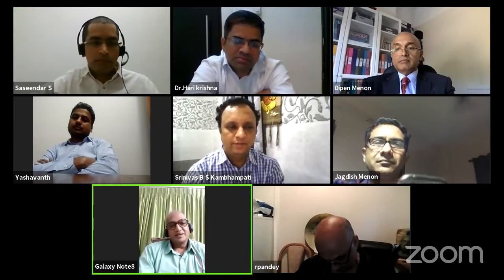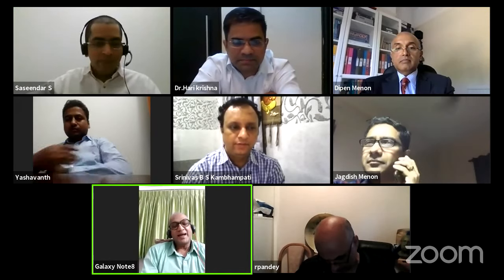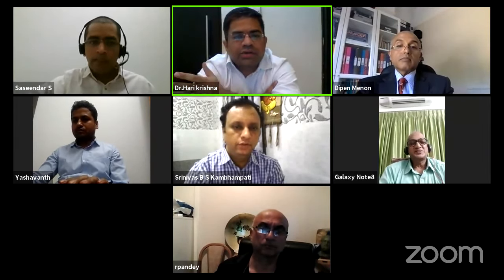Patra sir, do you have any tips that you can share with us? No, not much, but I want to say for the beginners, before you choose your portals and put your scope inside, how about distending the joint? Will it help? So I usually distend the joint for the shoulder. Before that, I put a spinal needle and 100 ml NS. I distend the joint, then I put the scope. Definitely, it'll be a better visualization.